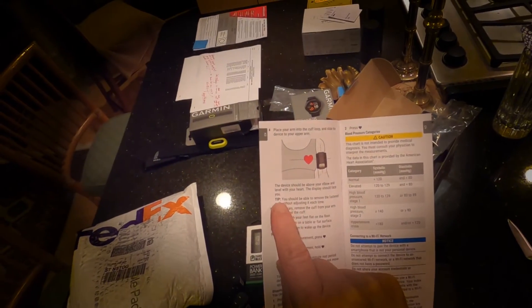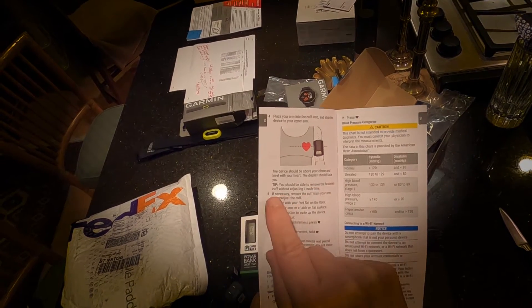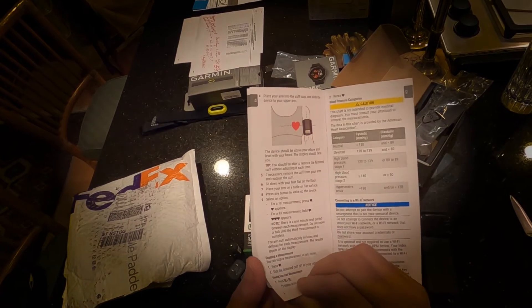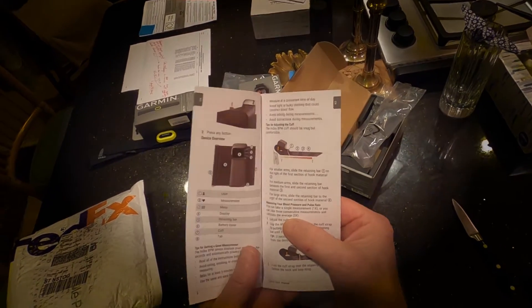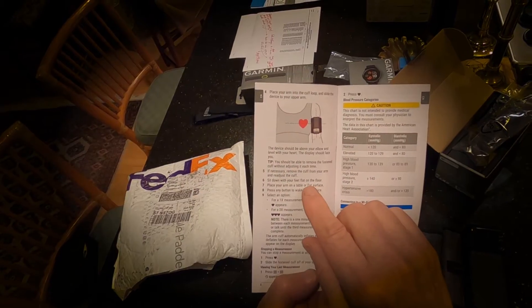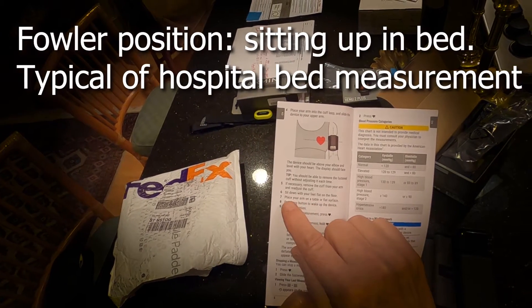Here's an interesting tip: you can adjust this thing so you can remove the cuff without adjusting it each time. There's also a provision for calculating the averages of three measurements in a row. You need your feet flat on the floor — I never do that. I sit up in bed.